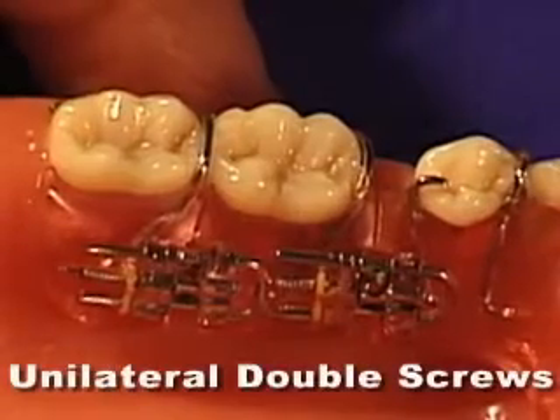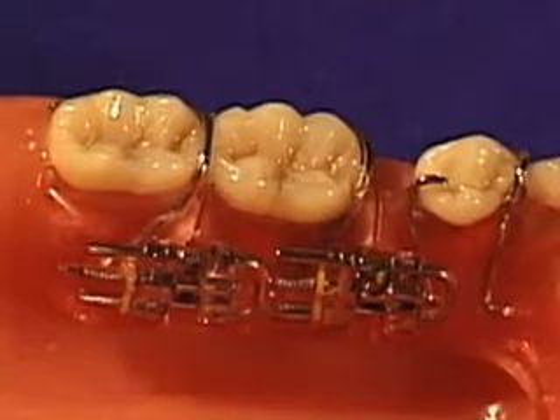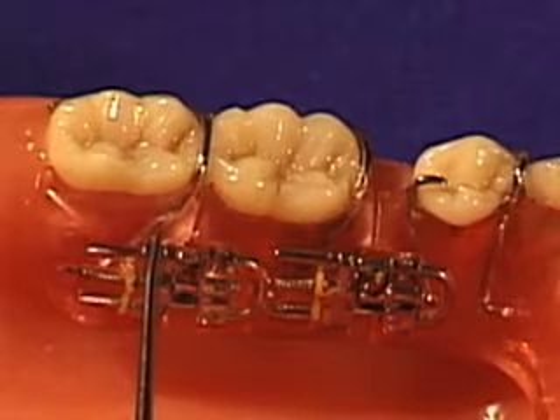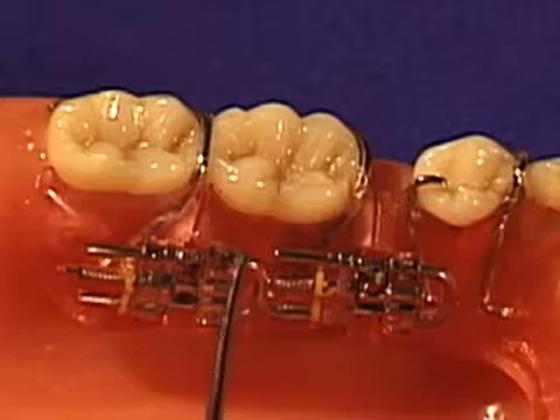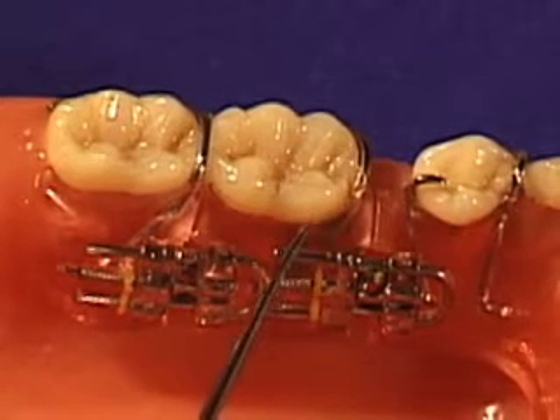When a first and second molar need to be distalized to create space for a bicuspid, it is often necessary to move one tooth at a time. A single expansion screw placed in front of the first molar is generally not sufficient to move back both the first and second molar. Having two screws in line will allow you to sequentially move your molars back.